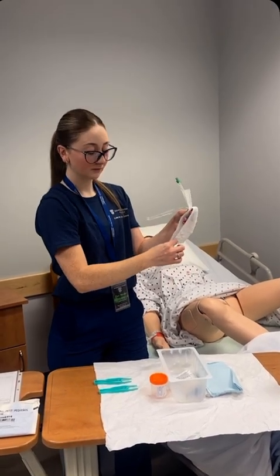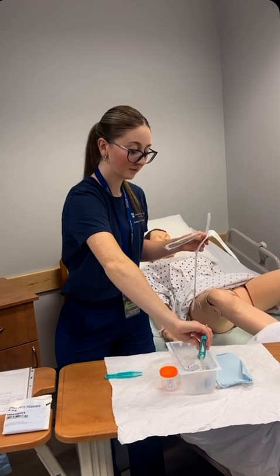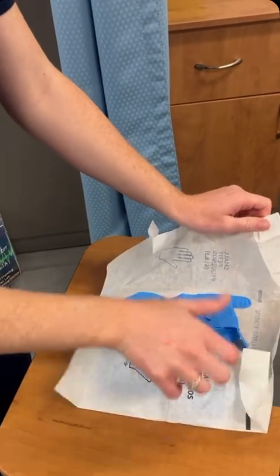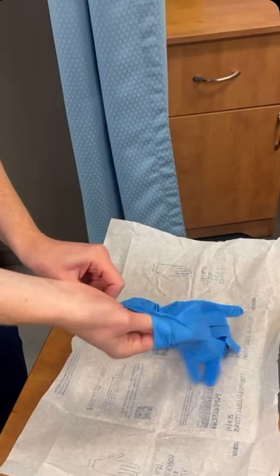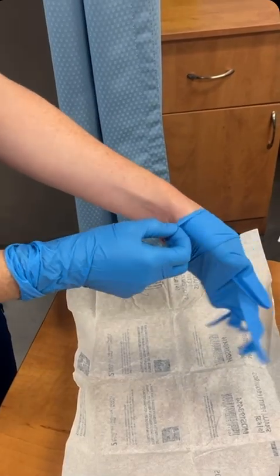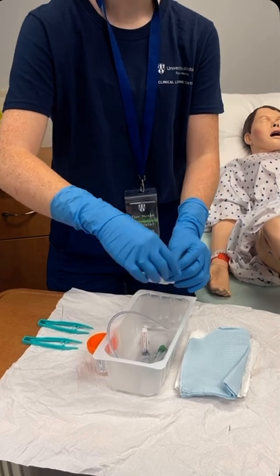If a solution is required for cleansing swabs, check the expiration date of the cleansing solution and pour off as needed. Cleansing techniques may depend on the catheter kit provided by the organization. Don sterile gloves correctly. Organize the sterile fields correctly.